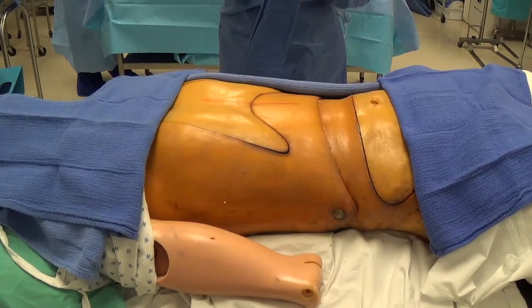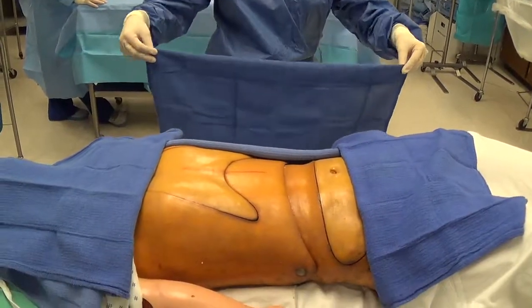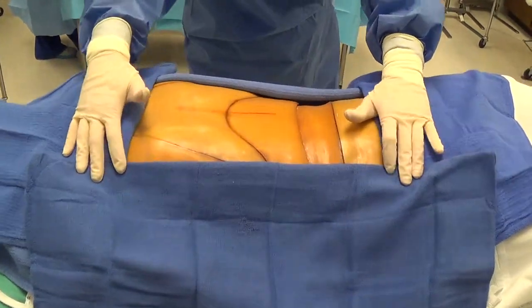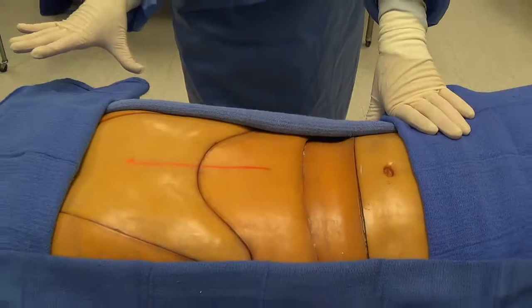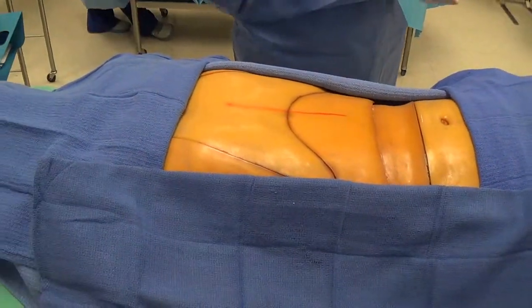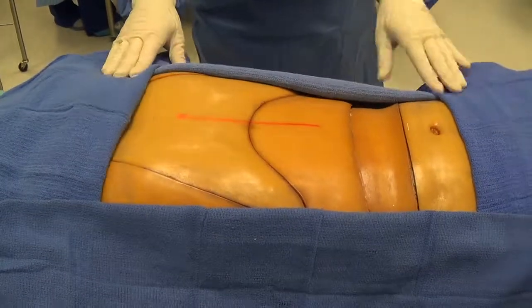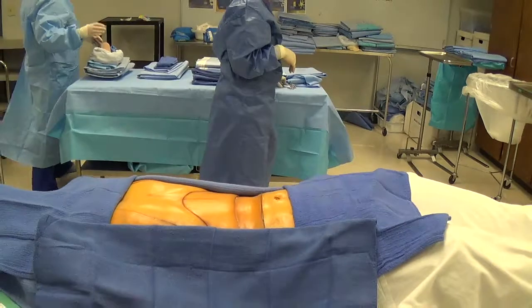On the last towel, make the fold so it goes towards you. Don't drag it on unsterile areas — reach across, watch how close the front of your gown is, and then place that last towel. If you want to move your towels back, touch only immediately surrounding the incision site — not out on the edge, since the edge is considered contaminated. Don't stick your fingers underneath the towels because you can't see that area.